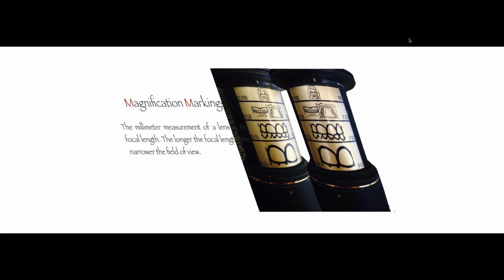On the next step, if I want to have all front teeth, MI position of the maxillary and mandible, or just an occlusal maxillary or an occlusal mandibular, I'm going to use the 1 to 2 range, and I'm going to use the f22 stop. And as you can see, that is on the sticker as well. That is on the marking. So you can copy the distance and the f-stop, the markings that are on this sticker, and you can use exactly the same distance and exactly the same f-stop, and you're going to achieve the same quality photos that I'm going to show you in a minute.